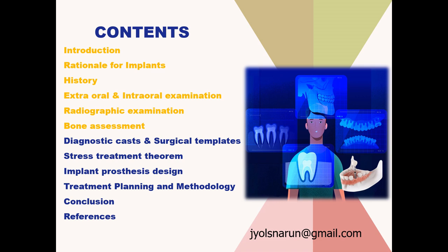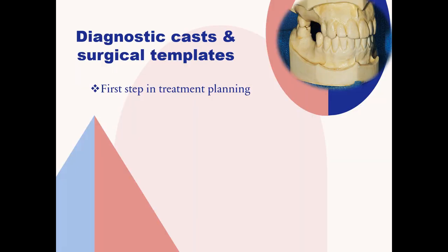So let's get into the topic. Now we know that the diagnostic cast or the study model is important in all phases of dentistry, especially in oral implantology. So this should be the first step in the process of treatment planning for dental implants. And diagnostic cast should be accurate reproduction of the maxillary and mandibular arches, and we have to mount these diagnostic casts in order to get the accurate maxillomandibular relationship.